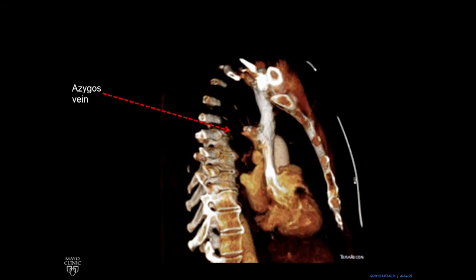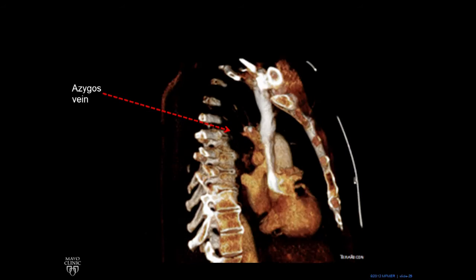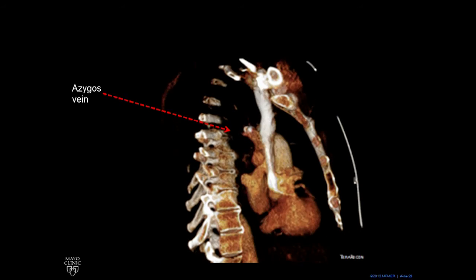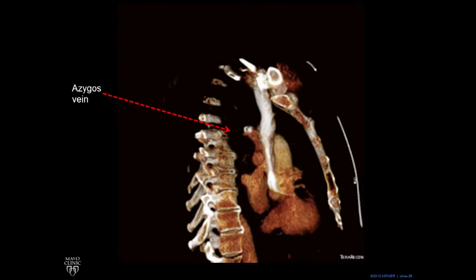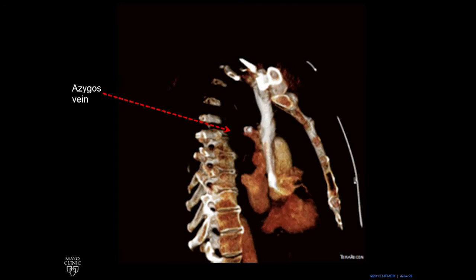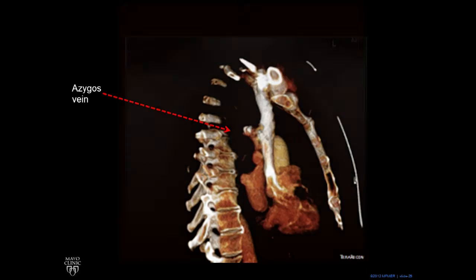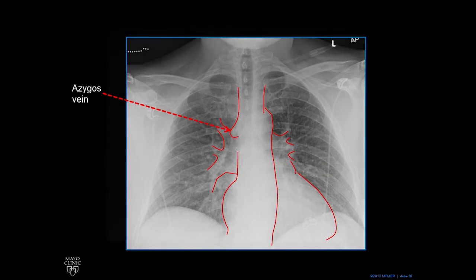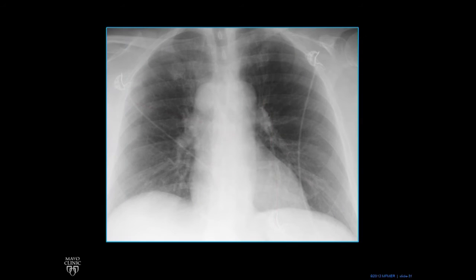The rest of it is not well seen here. This contrast, which is what's making the superior vena cava white, is showing up well. It's refluxing backward into the azygous vein. The rest of the azygous vein is not as opacified. What we have here is this abnormal contour in the region of the azygous vein.